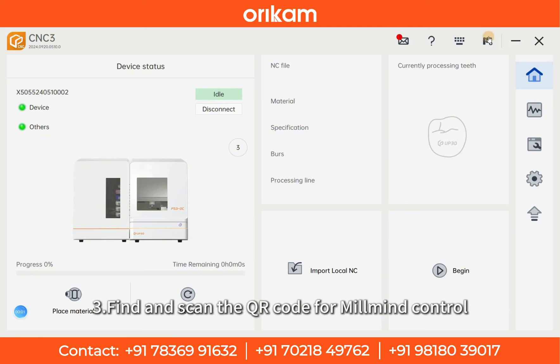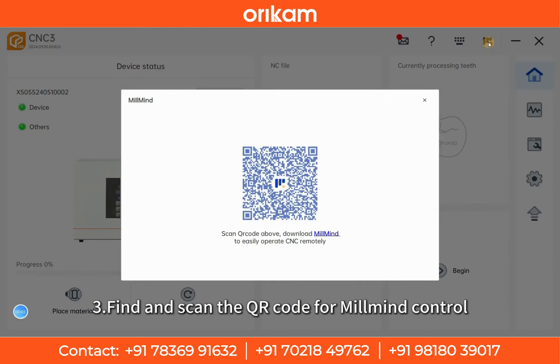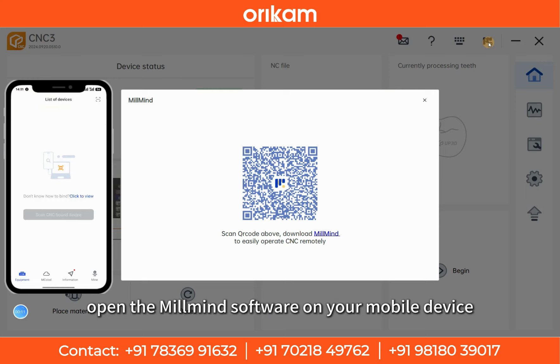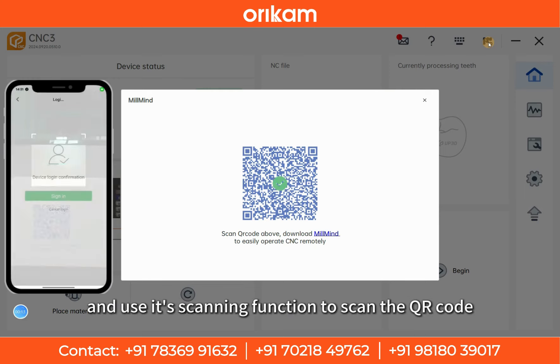Step 3: Find and scan the QR code for MillMind control. In the CNC3 software, find the QR code page for control. Then open the MillMind software on your mobile device and use its scanning function to scan the QR code.